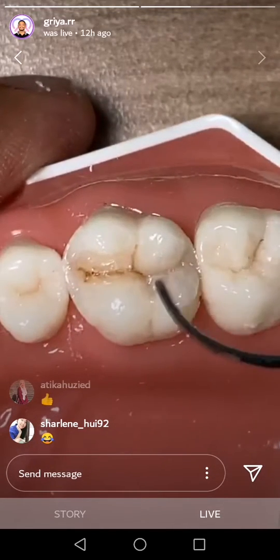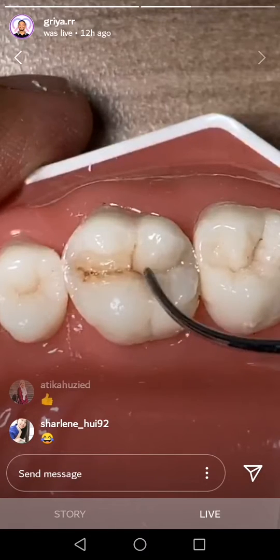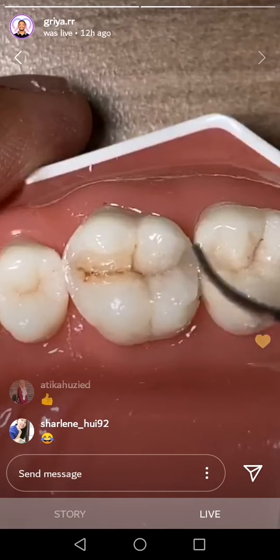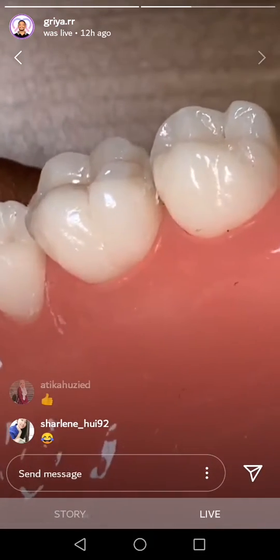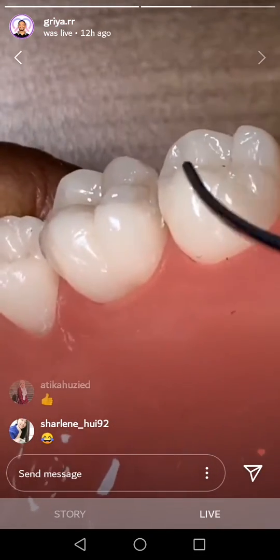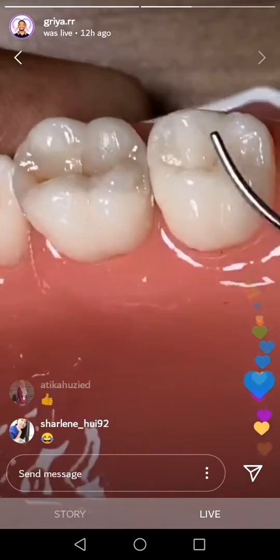Oh, I need to retouch again like this. Okay, now you can see from here. Oh, I have an excess. Oh, doctor, too much excess. Banyaknya nih. See? Yeah, it's okay.